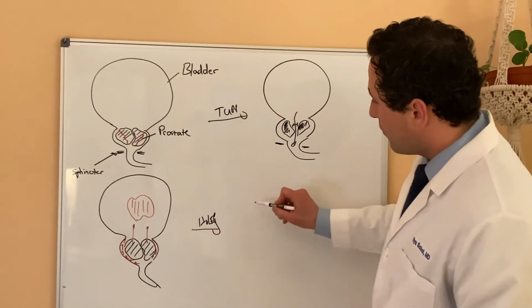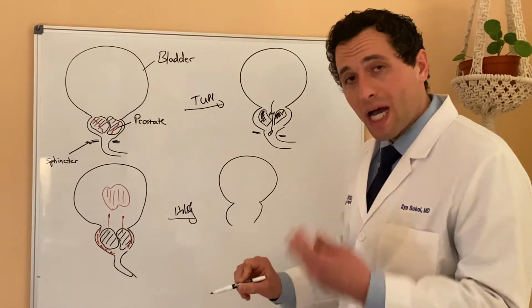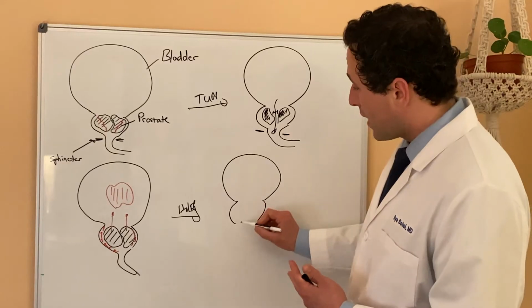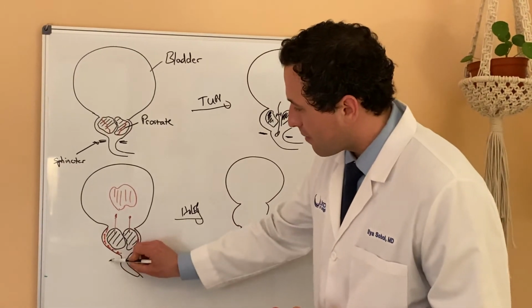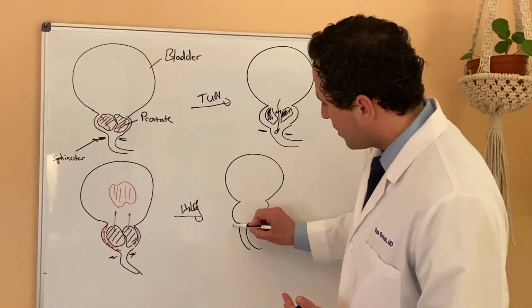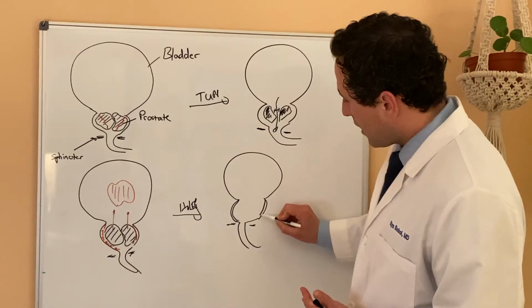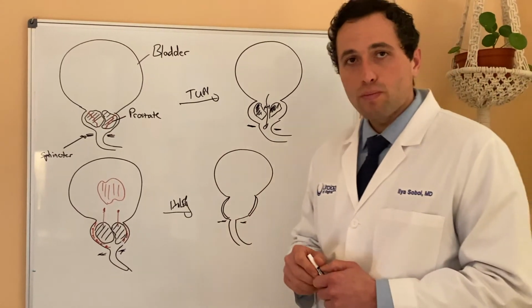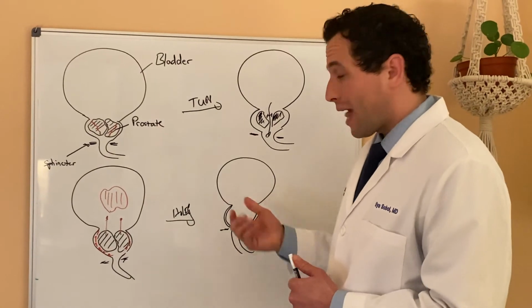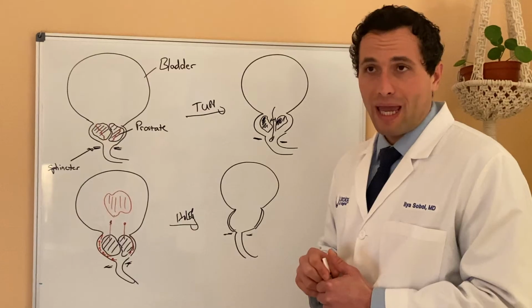So at the end, what you're left with is just the rind of the orange, just this big wide open channel. This is that muscle that controls urination. And this is your channel. And that's the reason that this is so effective for larger prostates and for bladders that don't work very well, because you've created the largest possible channel that you can.